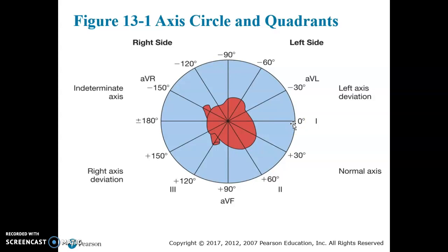AVF is negative, okay? So when I see that AVF is negative, I know that this is negative. This goes up because my negative numbers are on the top end of the stick here, okay? So we have positive and then we have negative.